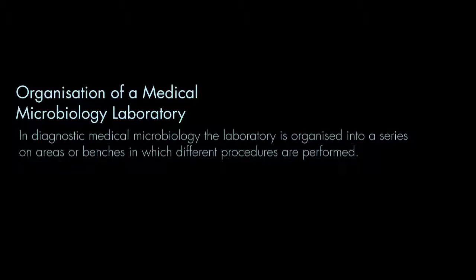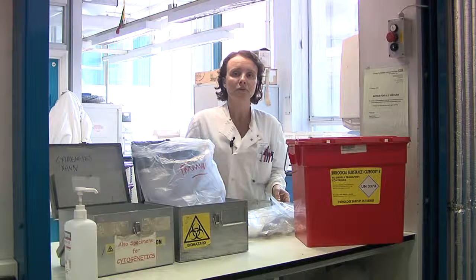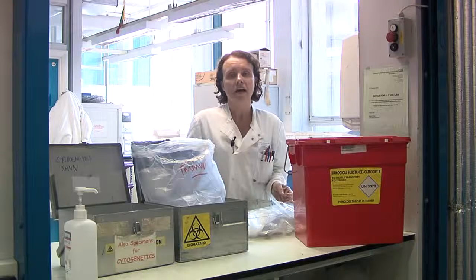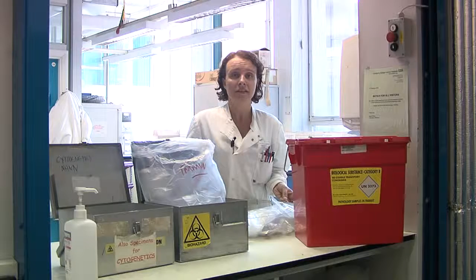This is the microbiology laboratory. This is specimen reception. Here all the samples come from various hospitals within the trust and other users of the service. Samples are sorted out by sample type for the various benches in the laboratory.